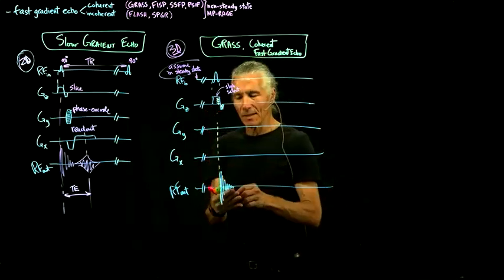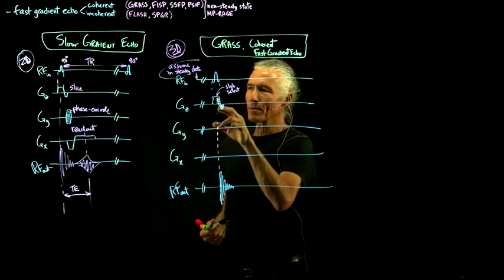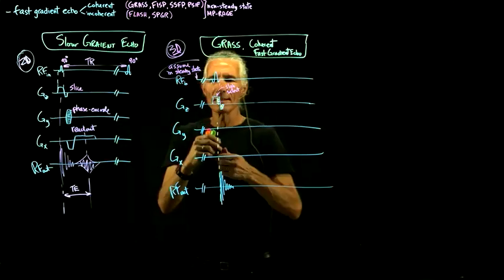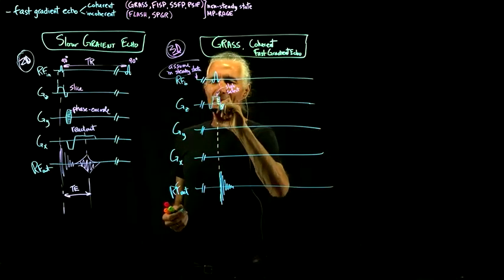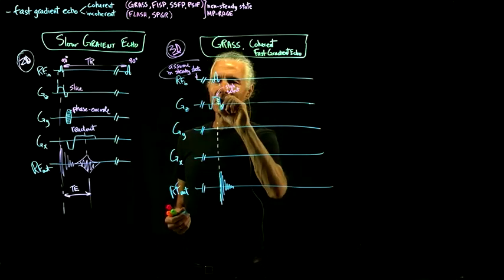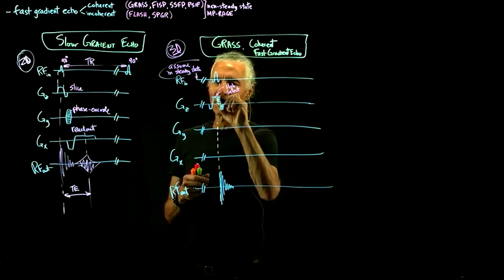But the problem now is that there's already some magnetization there before we started, because previously we were assuming, like in this case, that there's nothing here. And since there's already something there, we have to sort of pre-break things that this part is going to break. And then we add more RF, and then we post-unbreak things that we broke in this second half.